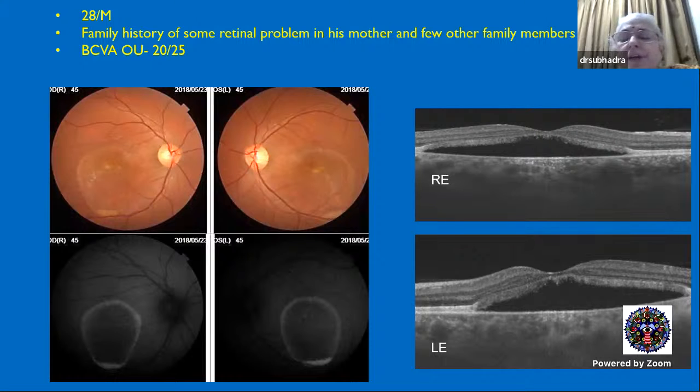In those patients, visual acuity will be very down. It will be 6/60 or something. Whenever you have a very good visual acuity and the OCT is not matching that, then the first diagnosis is Best. That is the clue. And go to the next.